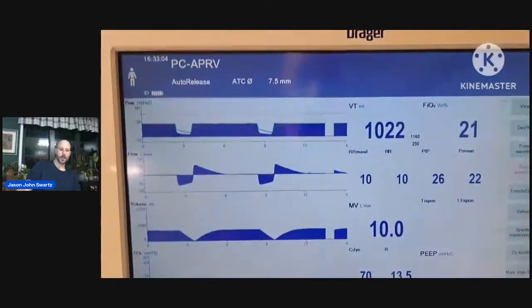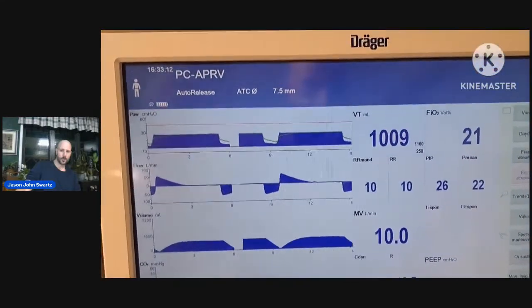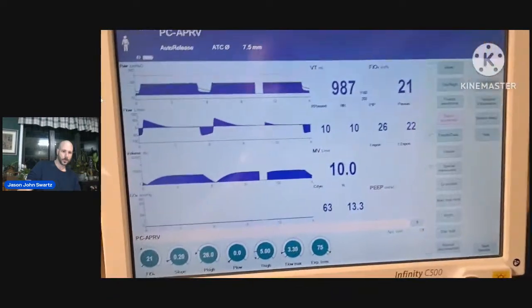Again, like I said, I'm not worried about that. It just makes sense that pressure over time has fully recovered half of the lung that wasn't present. I'm at 26, give it a few minutes and it's not optimal. Oh, great, the volumes are a little lower. Yeah, you're going to lose your lung. Don't worry, you'll get those normal tidal volumes of 700. Those 700 tidal volumes that he was taking on the conventional mode were when he had half a lung, not on purpose to try and keep it very high.